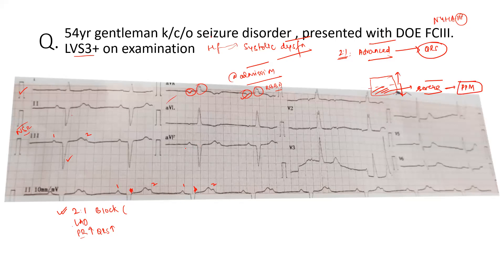The QRS appears a little wide, and the PR interval is also mildly prolonged. So there is a 2:1 AV block. There is a left axis deviation — pathological left axis because lead two is also negative. There is mild PR prolongation with wide QRS, indicating infra-hissian block.